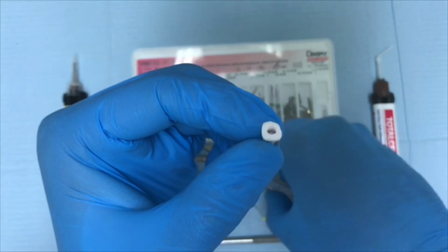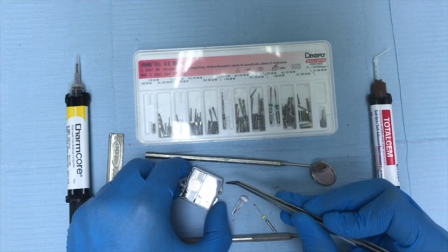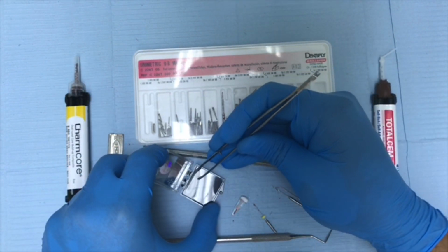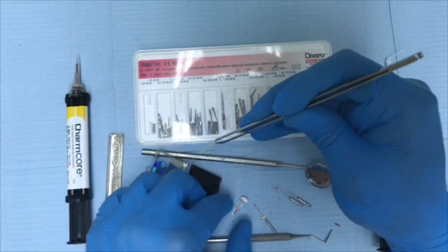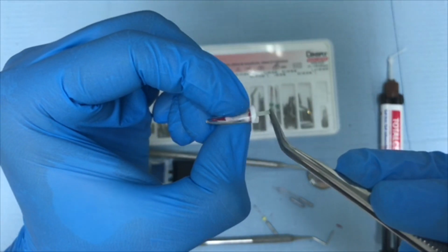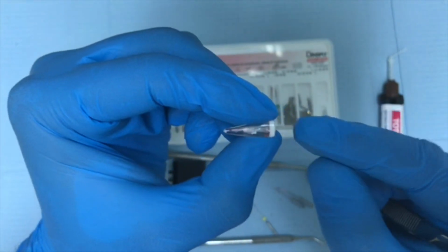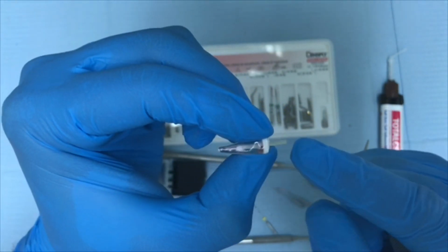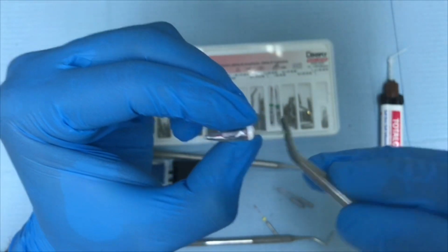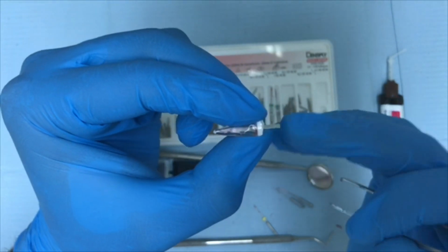Now let's try or check the post inside the root canal. Okay, it is perfectly fitted inside the canal, as you can see here, reaching the full preparation length.